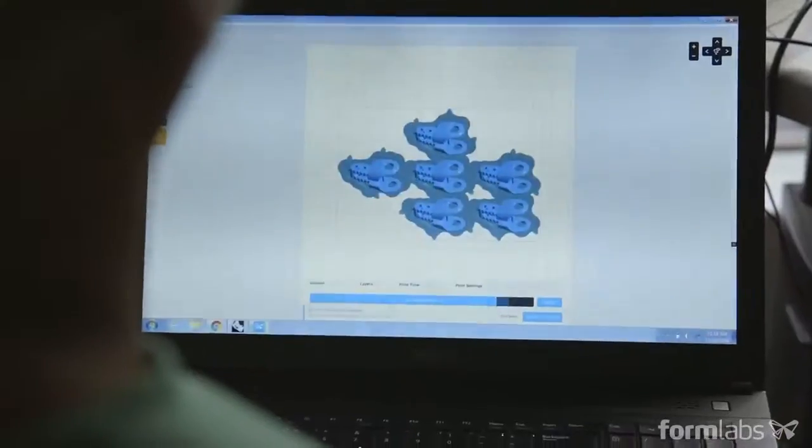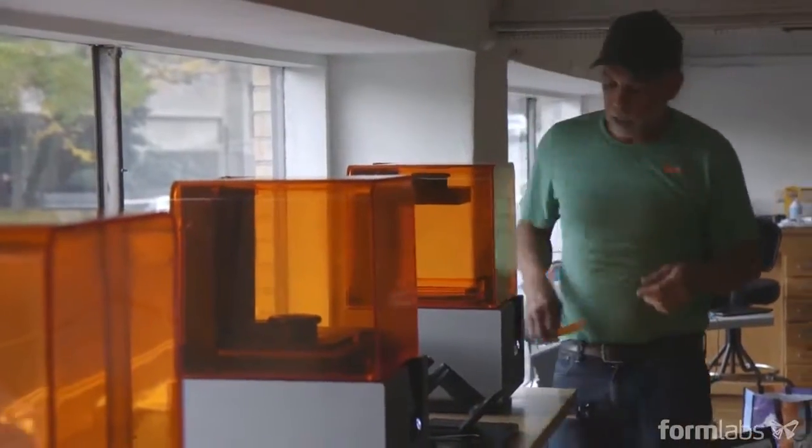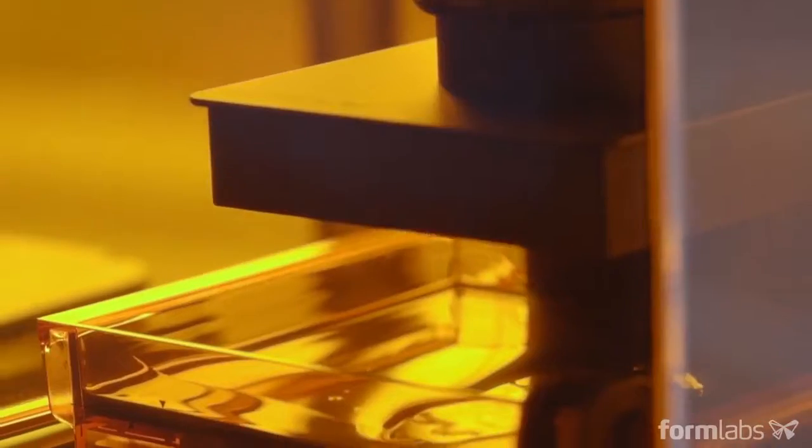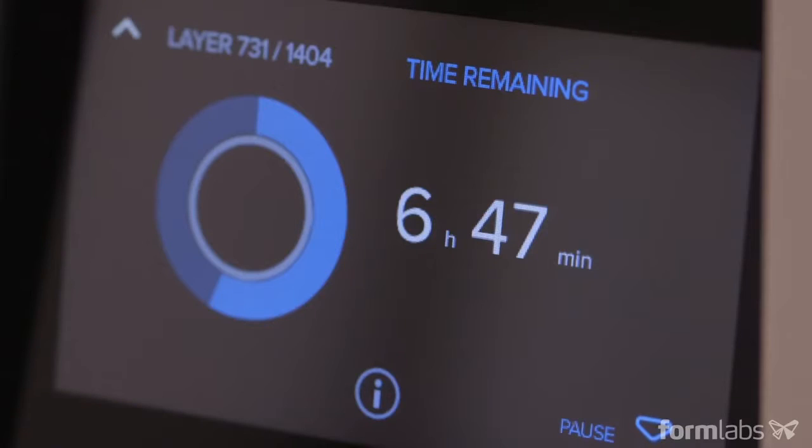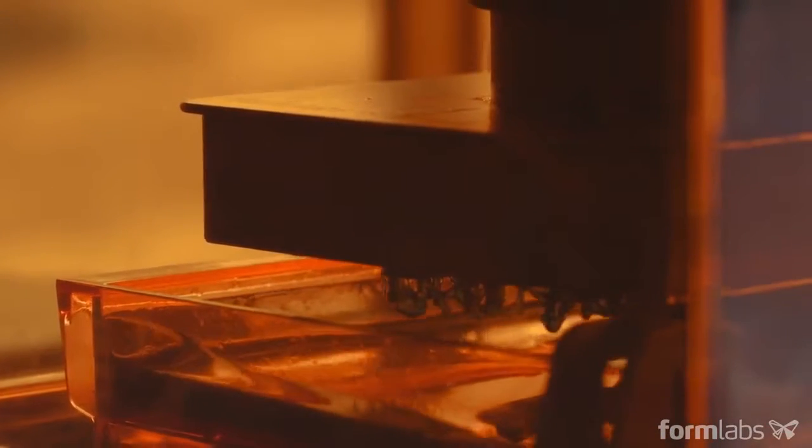We're at the stage of development with the prosthesis where we felt like, okay, we have a product. After measuring a patient, we're able to design the size of the hand that we want, click print, and within 24 hours start assembling. I don't need $70,000 pieces of equipment. This is everything that I need.